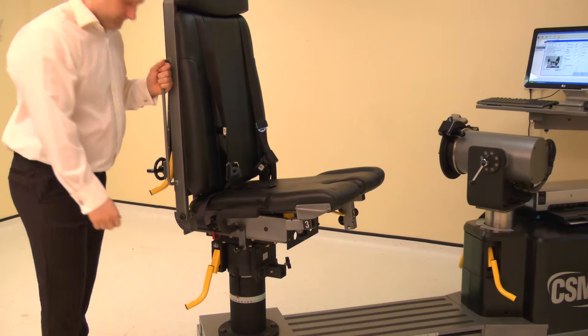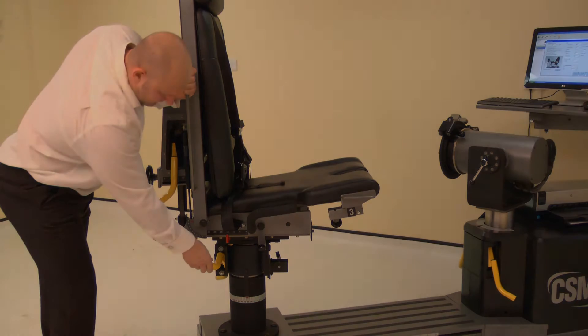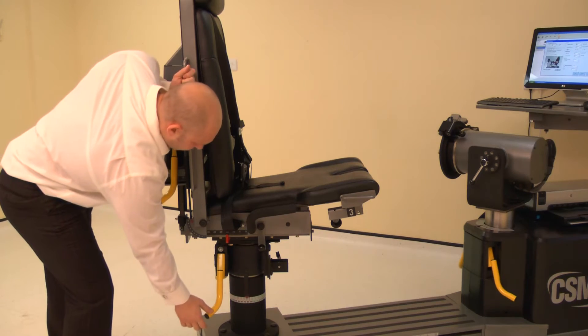Now adjust the chair rotation. Lift the locking handle and rotate the chair to 80 degrees on the green scale. Ensure both locking handles are pushed down to secure.